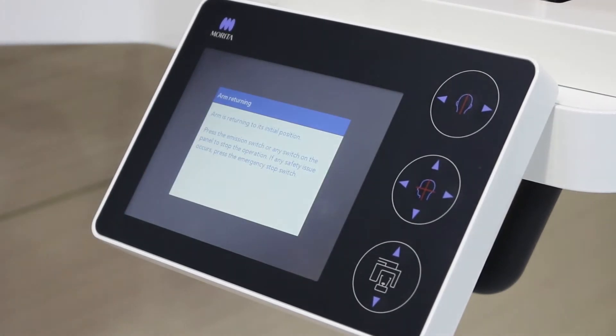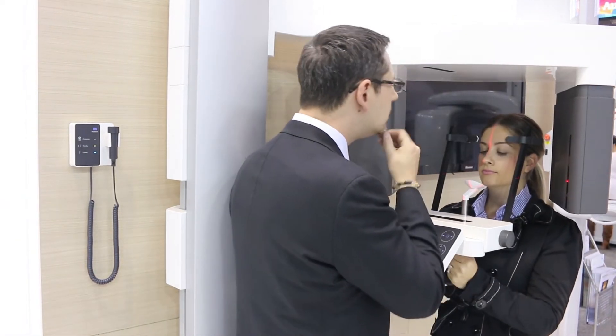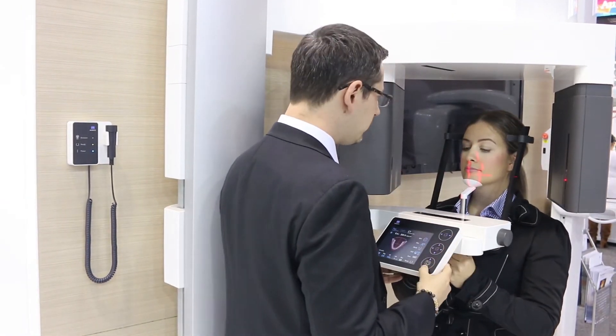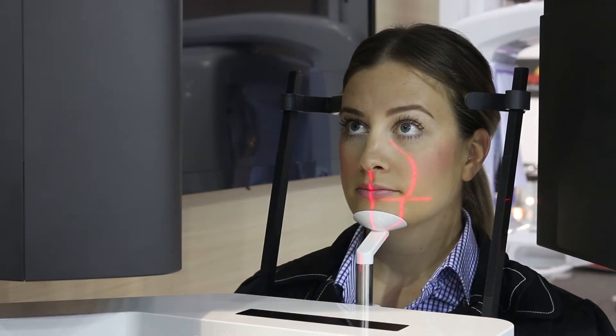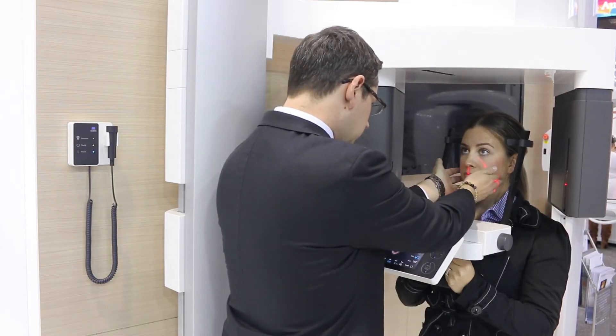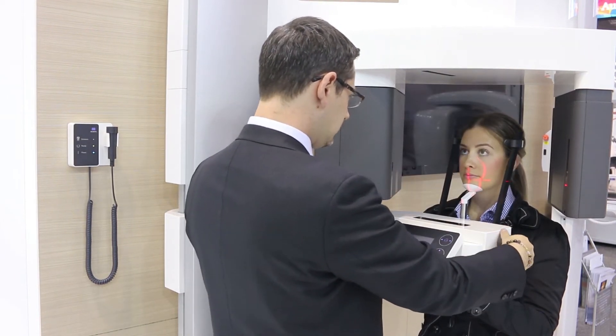Now adjust the height of the X800 arm so the chin rest slightly sits higher than the patient's chin. Slightly lower the X800 patient arm to achieve a horizontal occlusal plane. Adjust the patient's head position so the centre of their face is in line with the mid-sagittal laser beam.